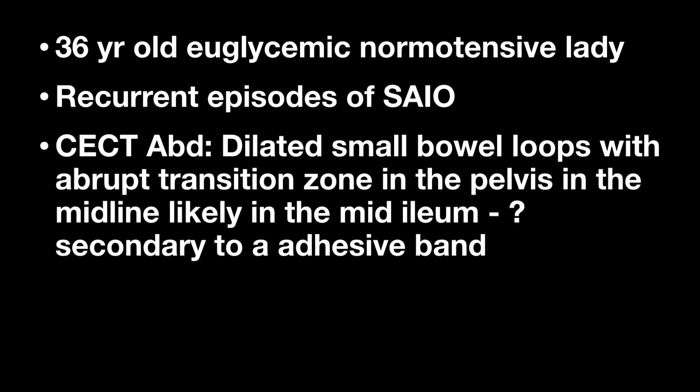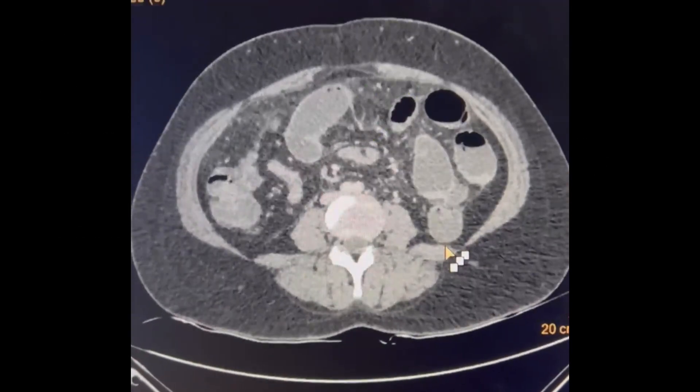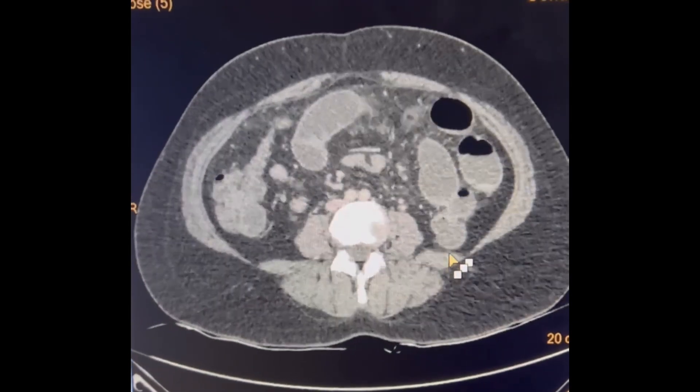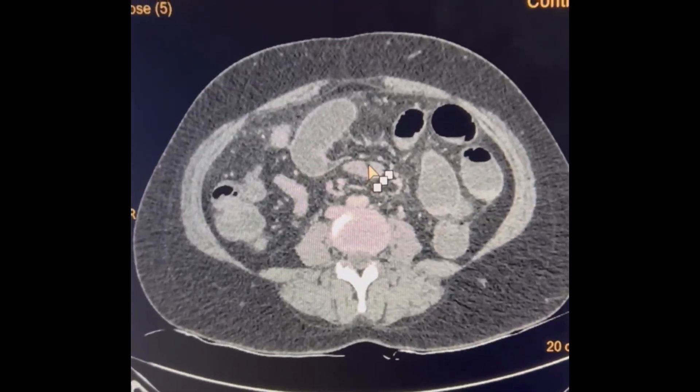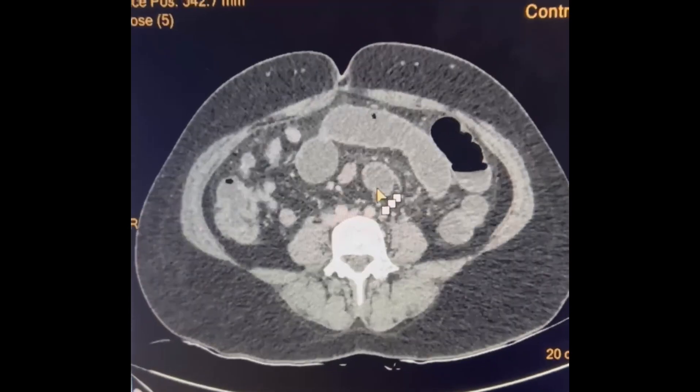Initially an ultrasound was done and then a CT was done, which showed multiple dilated loops with a transition zone in the mid ileum. This is the CT — you can see the dilated small bowel with a band, and some lymph node enlargement was also present.